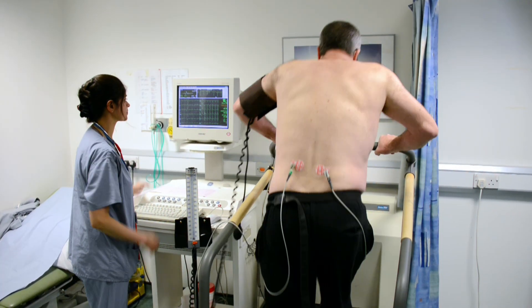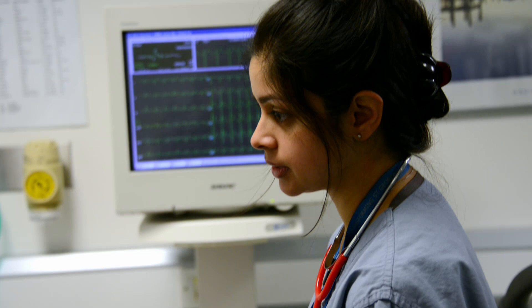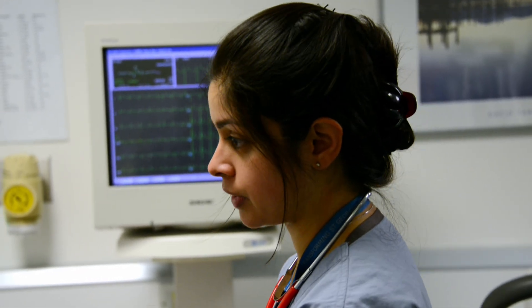If the patient's had enough or if we see anything significant, the machine is slowed down and then we recover the patient for at least five minutes. We want your blood pressure and your heart rate to come down to how it was before we started. Obviously you need to catch your breath first as well.